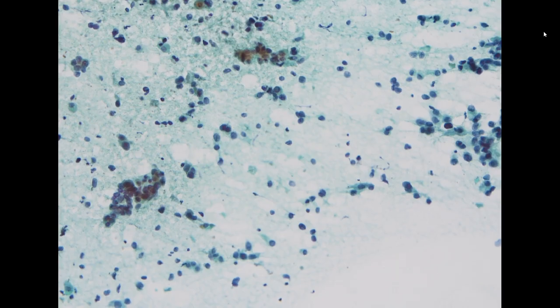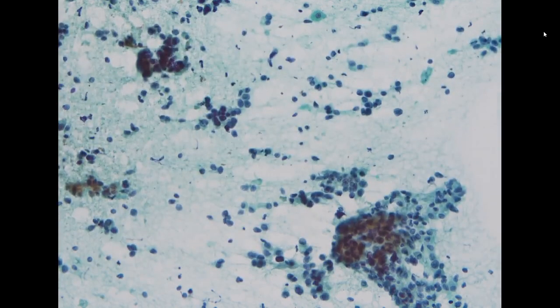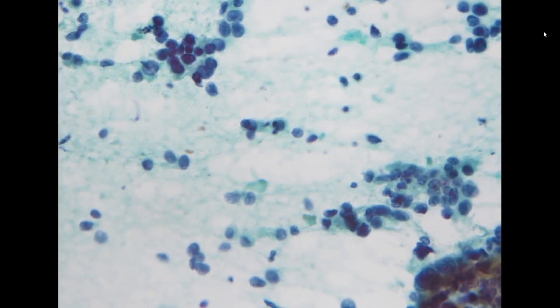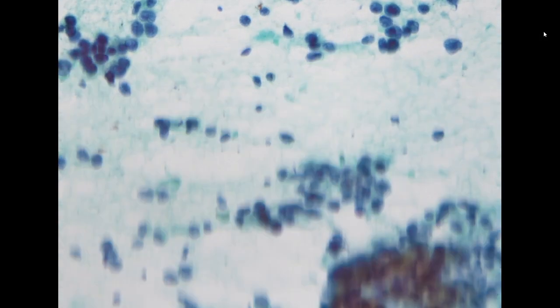So next, let's move to some aspiration cytology. The first one is from lung. The patient had a nodule in the lung, so she received CT-guided biopsy and aspiration. In this specimen, you can see the cell is very hyperchromatic.